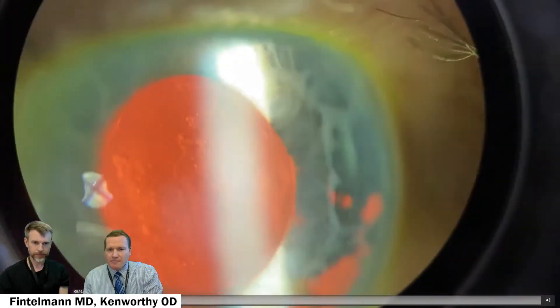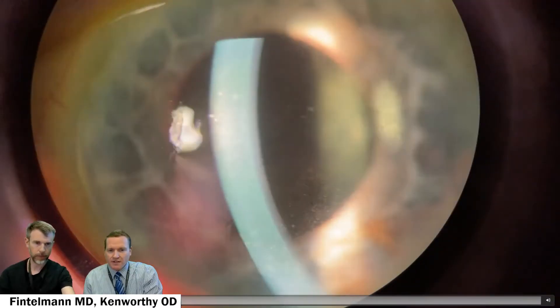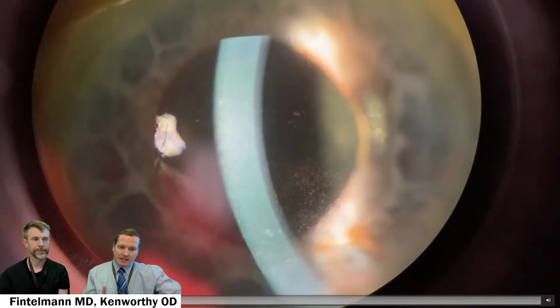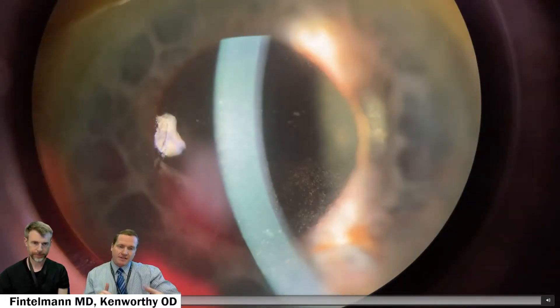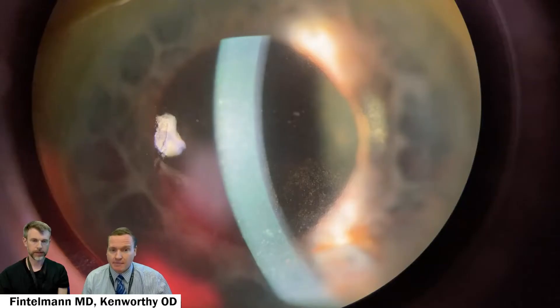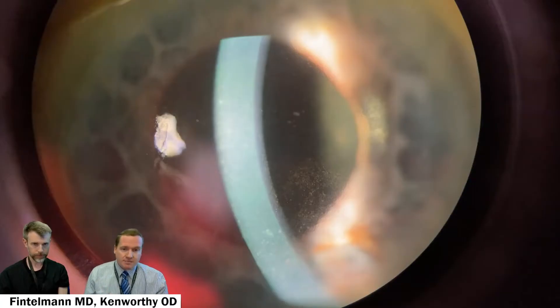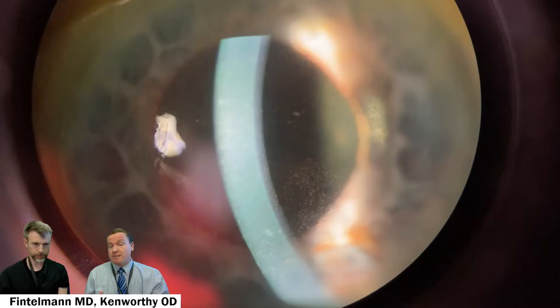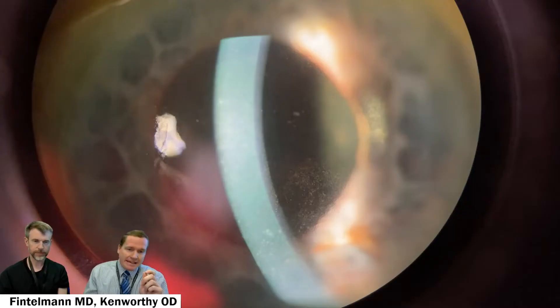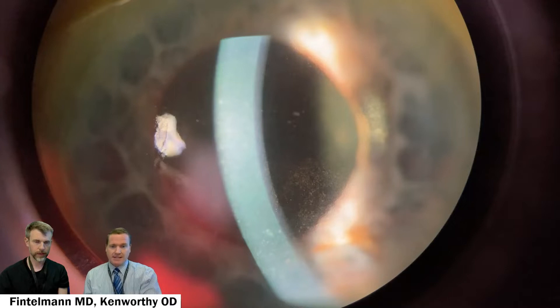It's also instructive to look at the cornea — at some of that pigment that looks like it's been liberated on the back surface of the corneal endothelium right there. That's another clue that something is wrong with this patient, more than just the PCO. This patient was referred for a YAG, but that would be a little too quick to go straight to a YAG in this case.